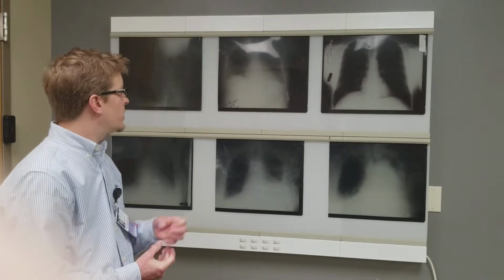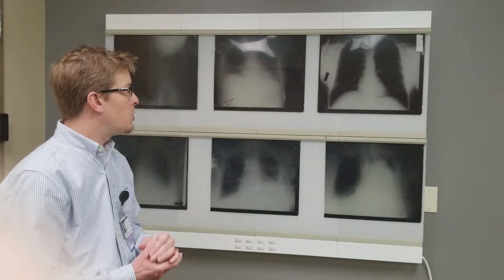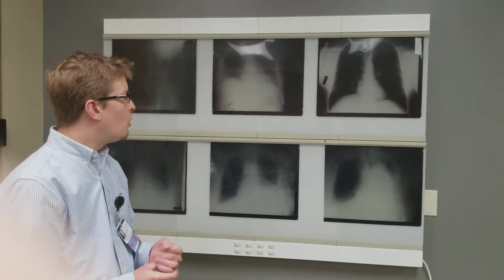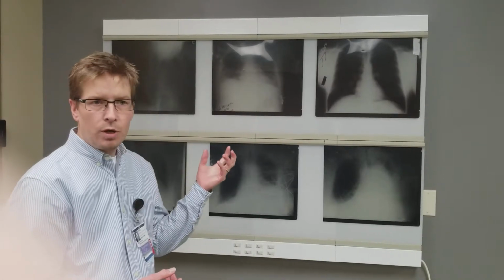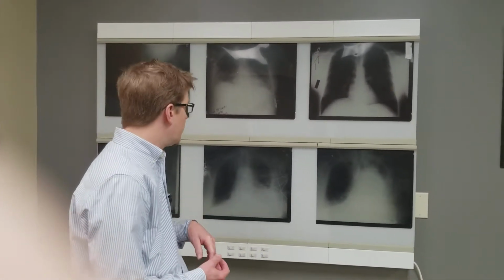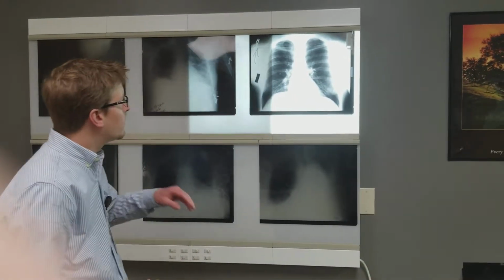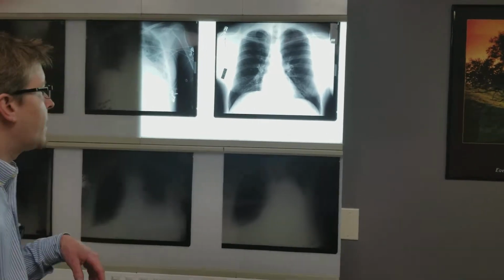Some of these things that we can learn will help direct our care. It'll help direct the modality of care. We'll go over what densities and what increases densities in the lung and outside the lung. So what we're going to do is first talk about a few things that people miss right off the bat.